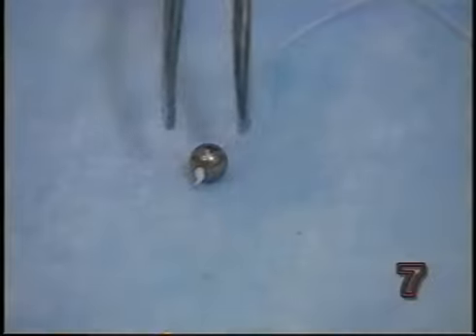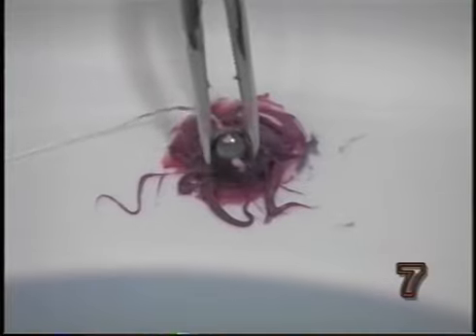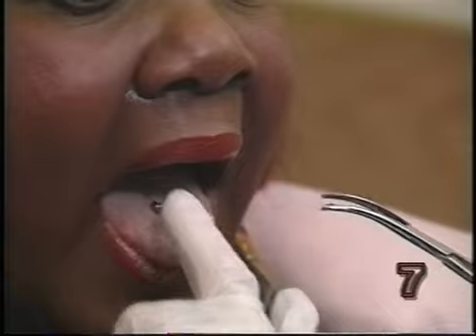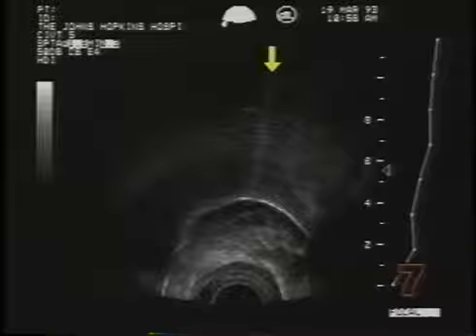If we attach a pellet to the surface of the tongue, however, and track the movement of the pellet, then we can extract all of the directional components of the movement. A pellet is attached to the tongue using dental impression material, which hardens and holds it in place. When we look at the pellet on the ultrasound image, we cannot actually see the pellet itself, but instead we see a reverberation artifact, which looks like a beam of light emanating from the point where the pellet is on the surface of the tongue. It's often called a comet tail.